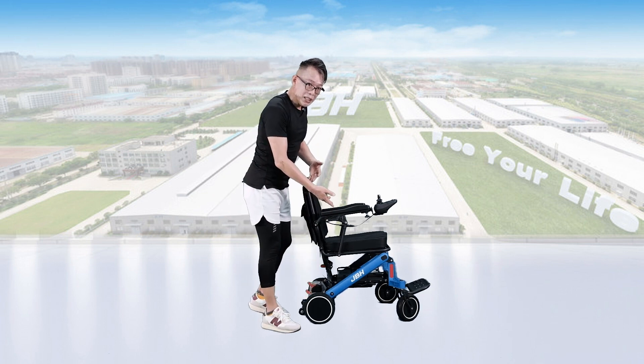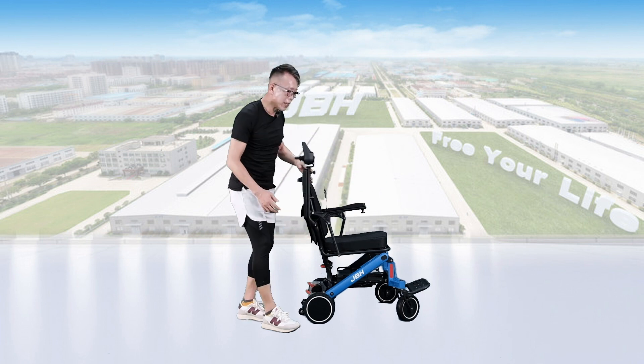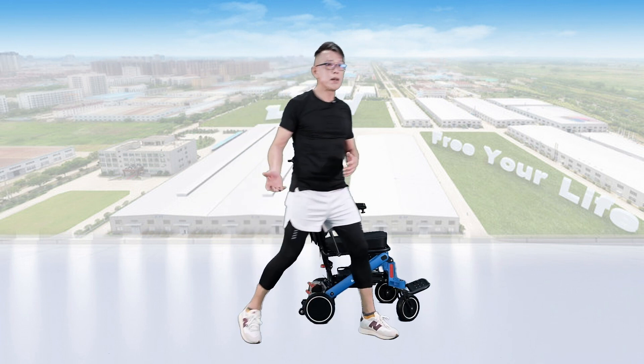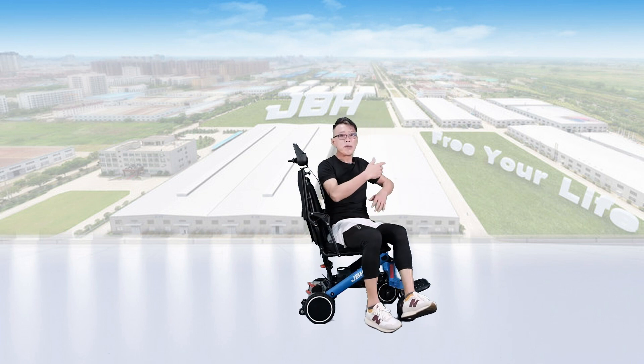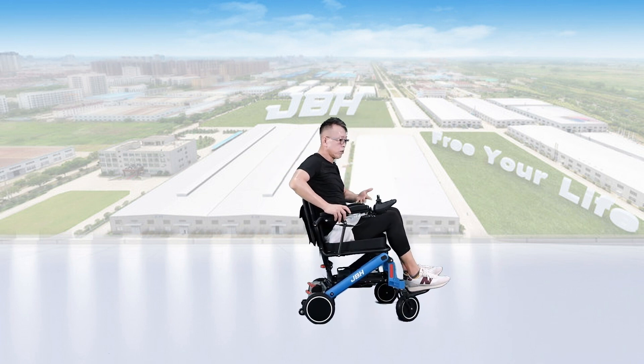In order to access the wheelchair, we need to flip up the armrest if you want to go through the side. Simply turn the lever of the armrest to flip it up, and then you can access from the side, or you can also go through the front.